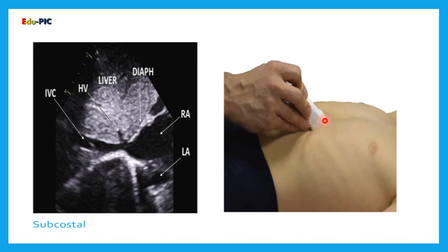So you can put your probe knob towards 12 o'clock, which means towards the patient's head, and the probe is a bit perpendicular. Maybe sometimes you need to angle it slightly to the right. Then you can see the inferior vena cava, which is connected to the right atrium, and from this view you can assess the volume status of the patient.